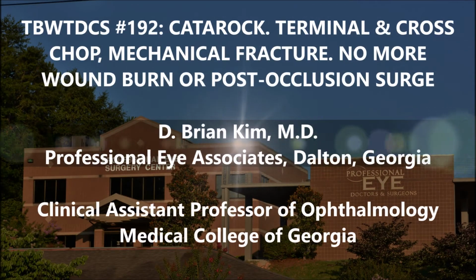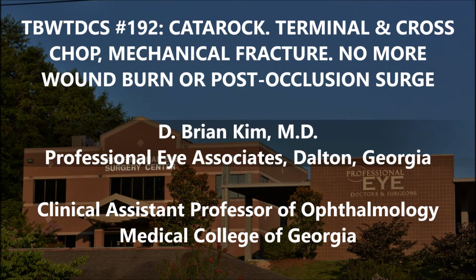I'm going to share with you case number 192 in the Best Way to Do Cataract Surgery series. This is a patient with a cataract, and you'll see that when I start the case. Now I'm going to perform terminal chop, cross chop, and leverage mechanical fracturing techniques in order to crush the lens between the instruments into smaller and smaller pieces.